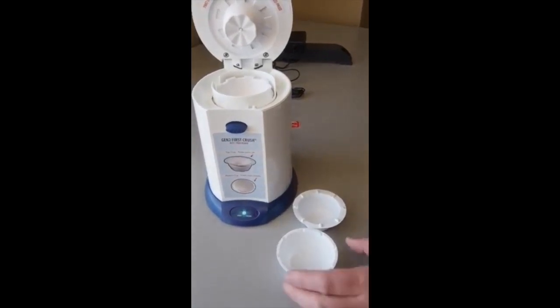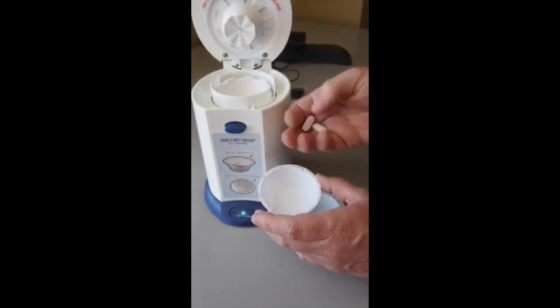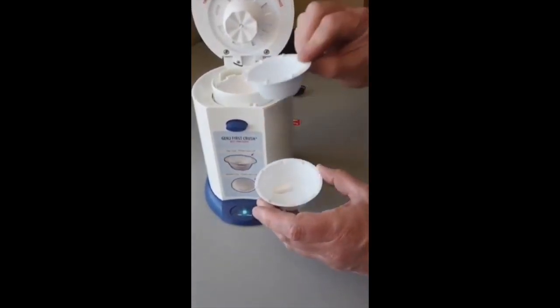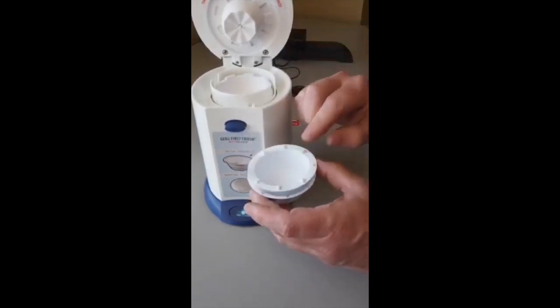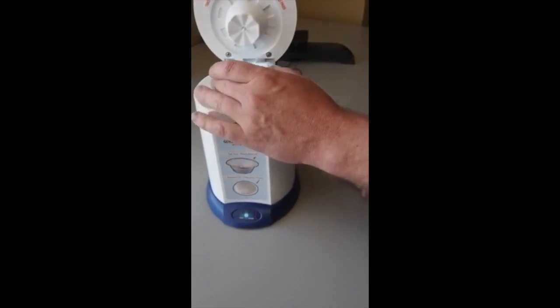When crushing, we typically recommend 5 to 6 medium-sized pills be crushed at once. If they're smaller pills, you can do more. If there's larger pills, you may wish to do less. Certainly this is with deference to your own policies and procedures.